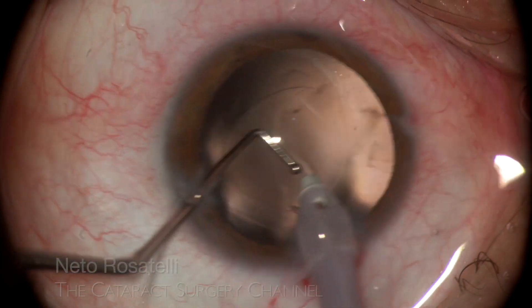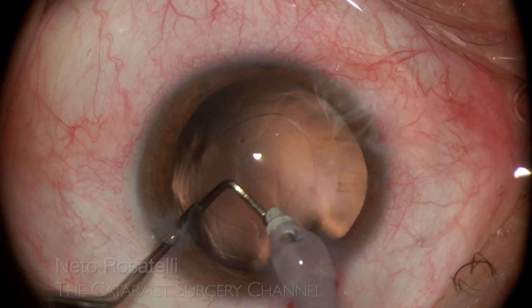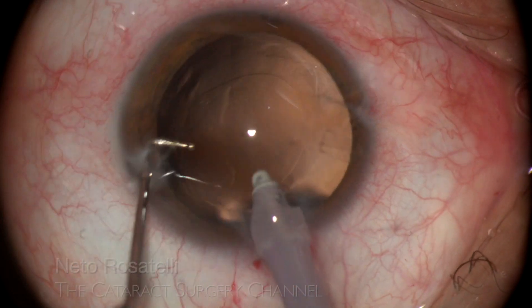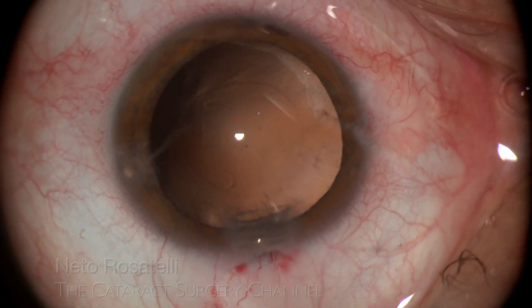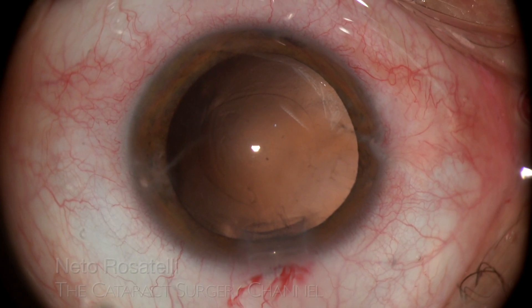Very gentle aspiration maneuvers must be done in order to prevent capsule entrapment and zonular dialysis. This time, the bimanual probe of this transformer handpiece didn't need to come into action.